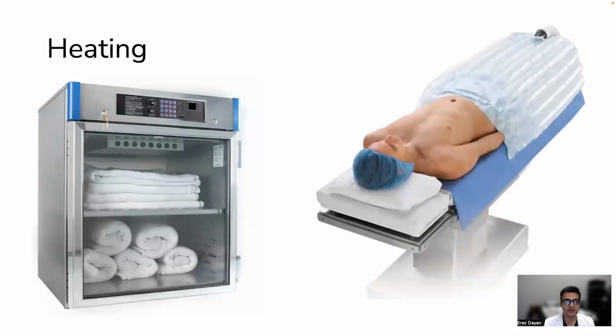Heating the patient is very important. So we want to make sure that the patient's warm, primarily to minimize bleeding and maintain homeostasis. You can do that either with warming blankets, or with a Bair Hugger, or there's also a pad called the hot dog, which you place under the patient to warm them. You have to consider the patient's going to be potentially in a cold room without much clothing, and you're injecting rather cold tumescent solution into the subcutaneous tissue. So ensuring that the patient is warm is important, not only for their comfort, but also for their homeostasis.